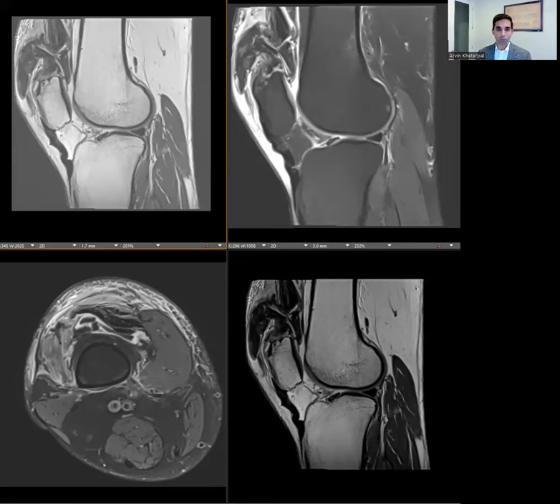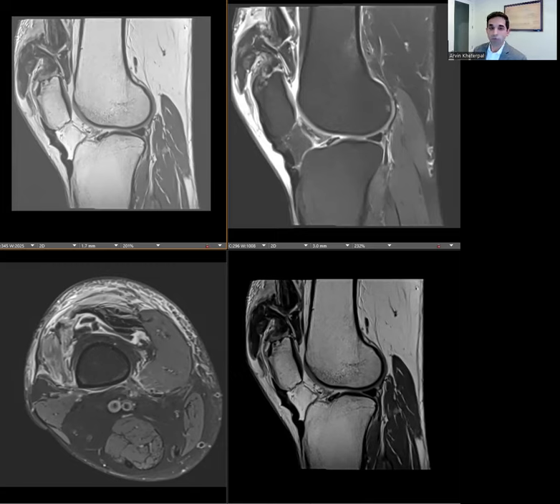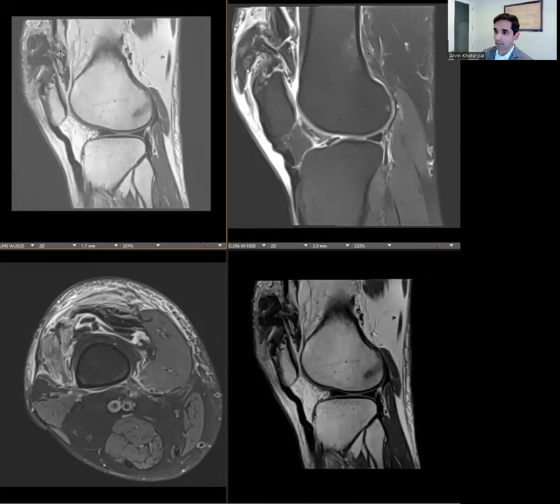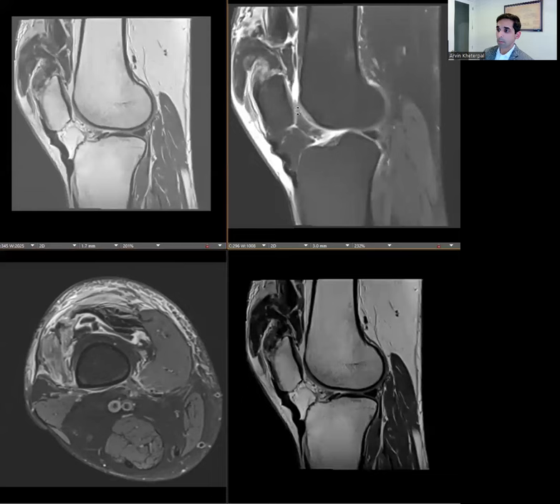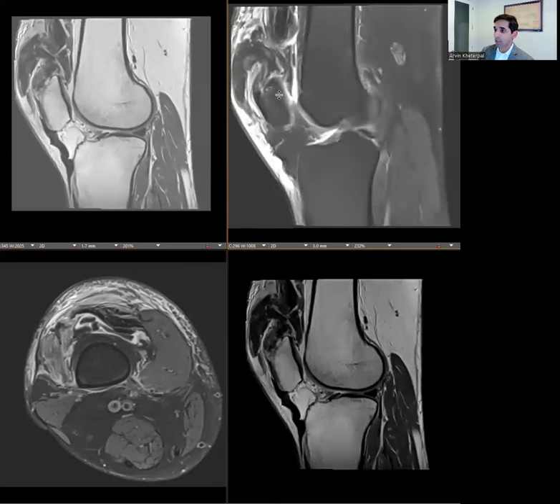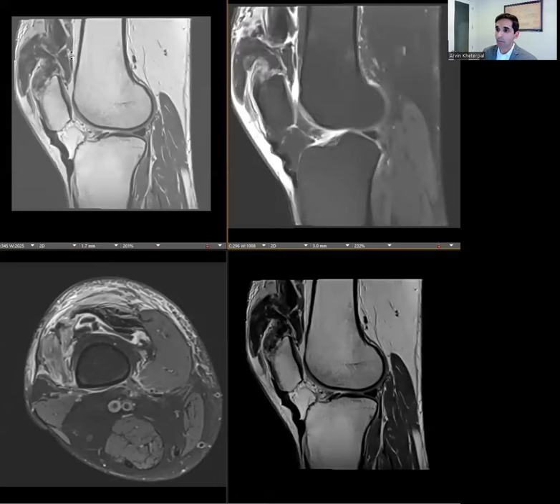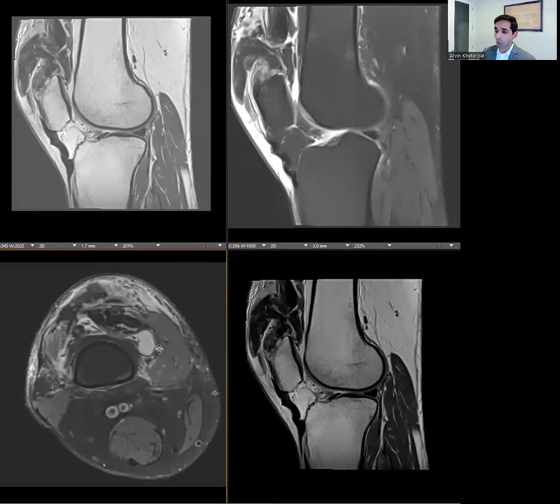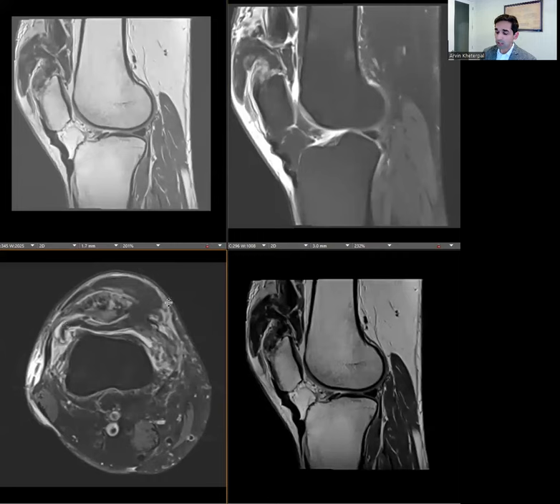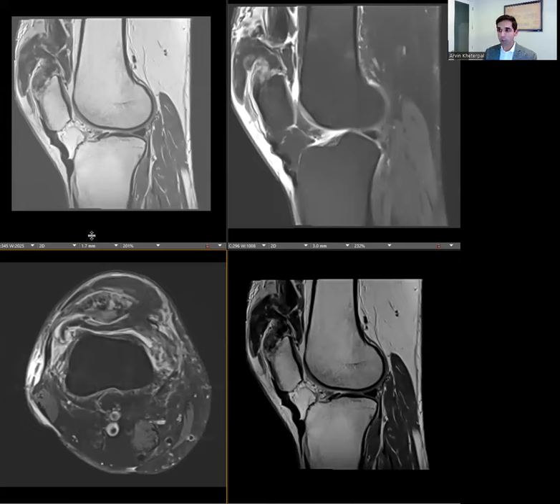Now we're going to look at a complete rupture of the distal quadriceps. Complete ruptures usually occur from either forced flexion or a direct blow to the quadriceps. In this case, we cannot follow the low signal fibers down to the patella. The patella also seems to be in an abnormal, slightly inferior location. There's low signal soft tissue coming out of the joint into the prepatellar soft tissues — visible nicely on the axial sequence. This is actually hemorrhage coming through the joint; sometimes it can be low signal as here, but sometimes it can be high signal joint fluid leaking through the defect.